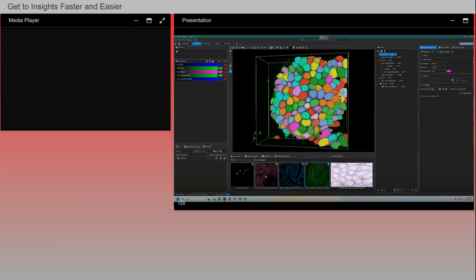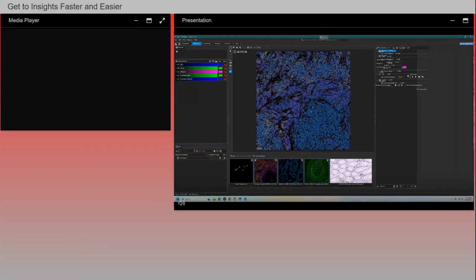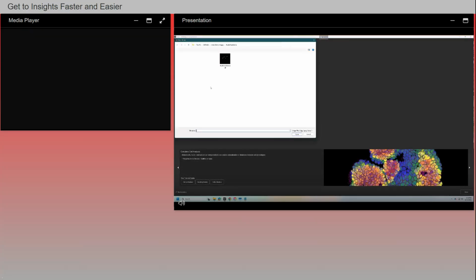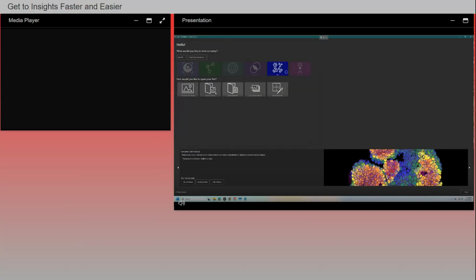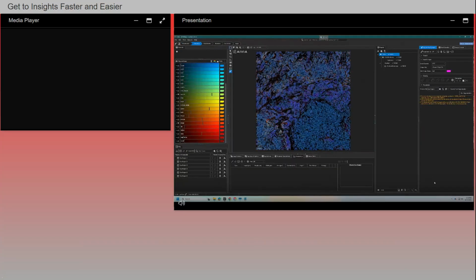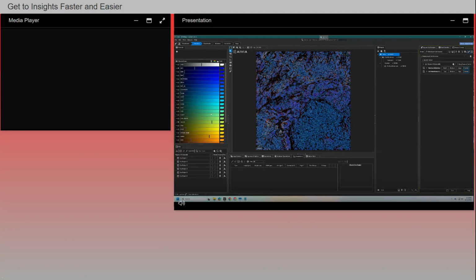Once you detect cells, then there are a number of things one could do. So now I want to move on to a more complex example to show you what type of interpretation is possible. So in this example, I'm going to use this multiplex image with 30 channel input obtained from CellDive. What I've done here is, when we go to the detection step, and this is one of the innovations we brought where we can apply a multiplex input for this rather complex image with a number of different channels for biomarkers that are interactive.